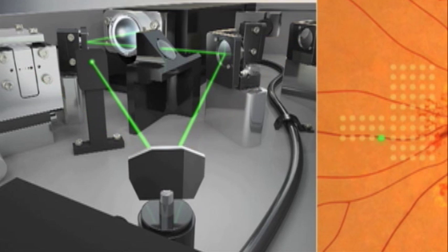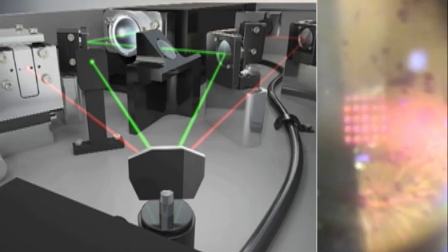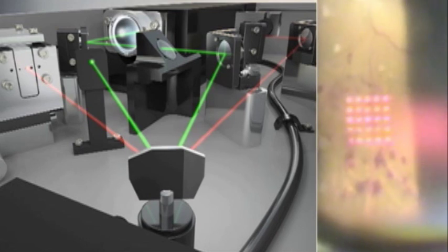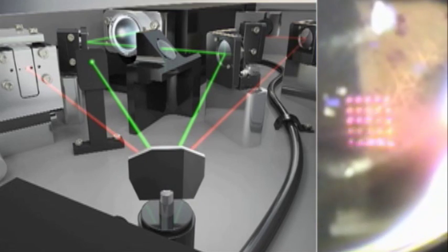PASCAL uses three high-speed computer-driven galvanometers to individually deliver each spot in the pattern, resulting in a 25-spot PRP pattern being delivered in approximately 500 milliseconds.